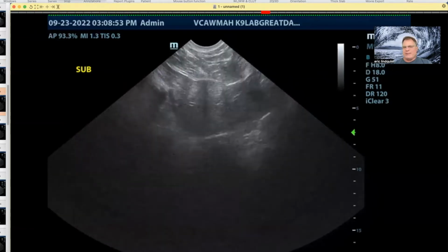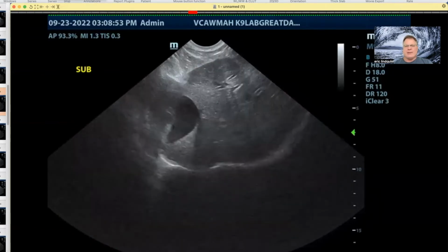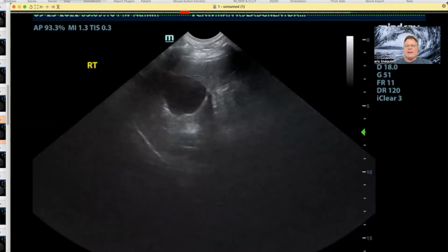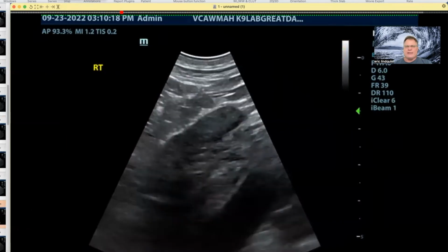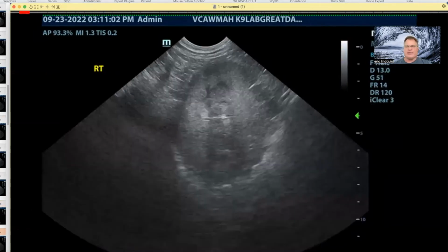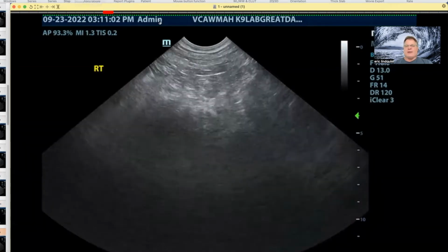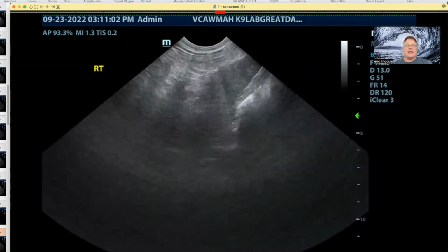And if the splenic mass is isolated, then it very well could be histopathologically benign, but obviously this is bleeding and it needs to have surgery right away. But we know that mass belongs to the spleen. Here's a right adrenal, the left adrenal was fine. So we know this wasn't an adrenal mass. The pancreas was not a player. But we also get another view of this mass from the caudal approach.